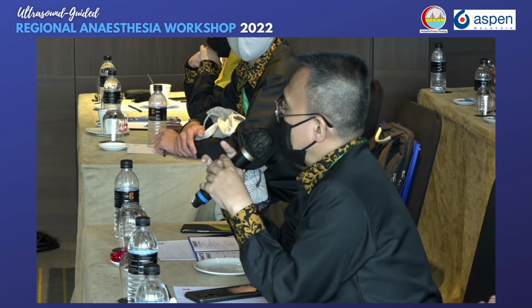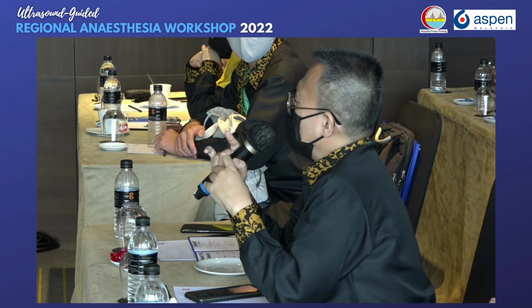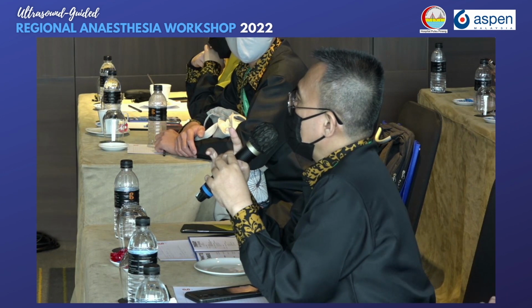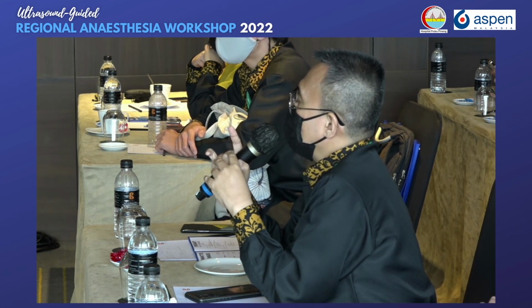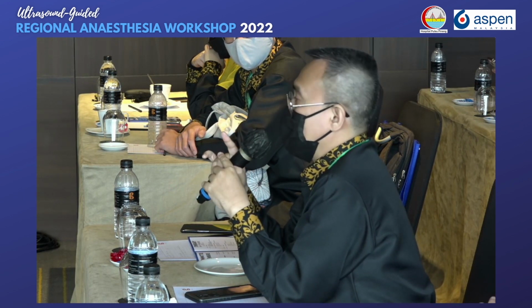But for incisions over the upper arm and also the top of the axilla, you want to block the intercostobrachial nerve, which comes out from the T2 dermatome. So you don't want to block at third, fourth rib for the second injection for a vascular access surgery.